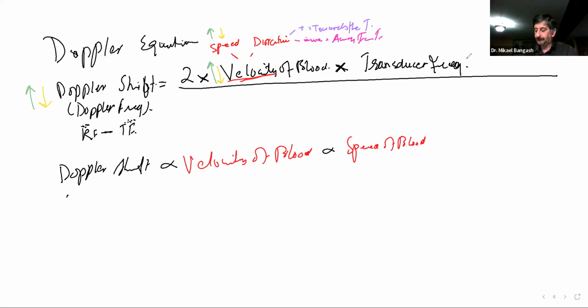Did you guys get that? Now, what did we mean by the transducer's frequency? The frequency of the transducer, right? Which frequency is that referring to? The main frequency of your transducer. Is that clear?